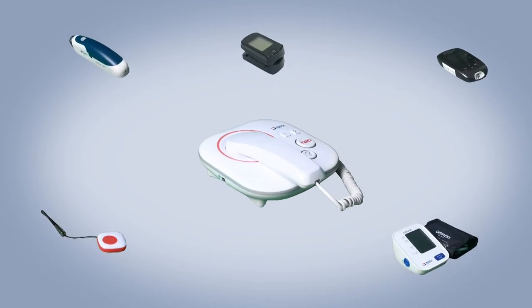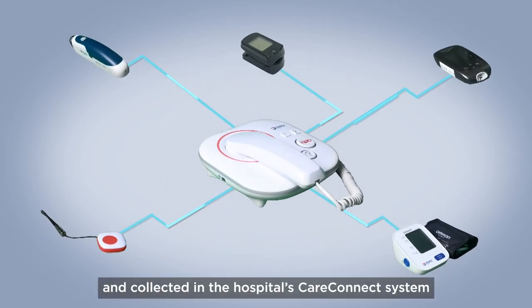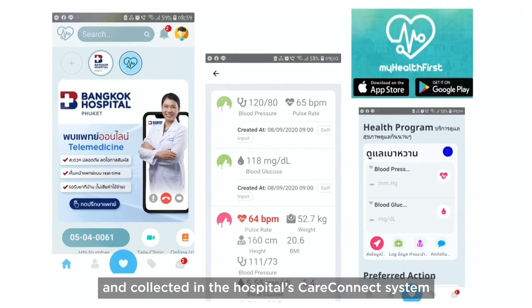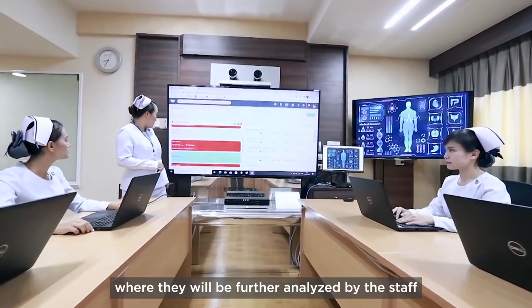Bluetooth measure completed. The readings are then transmitted to the base unit and collected in the hospital's CareConnect system, where they will be further analyzed by the staff.